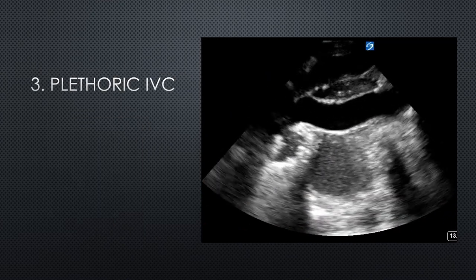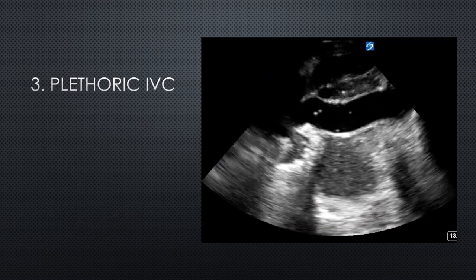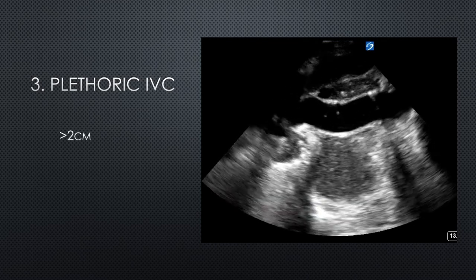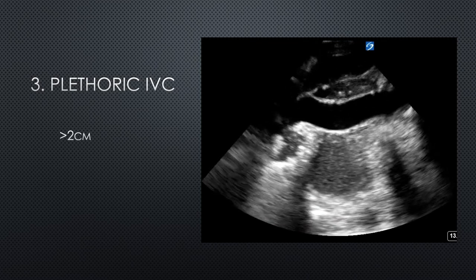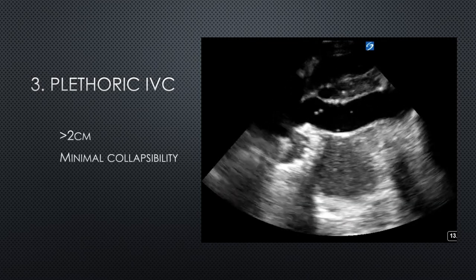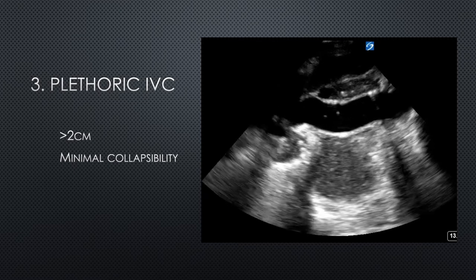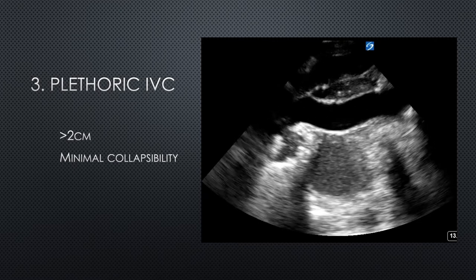Here is an example of a plethoric IVC. The IVC is more than two centimeters in diameter, and there's minimal respiratory variation or collapsibility.